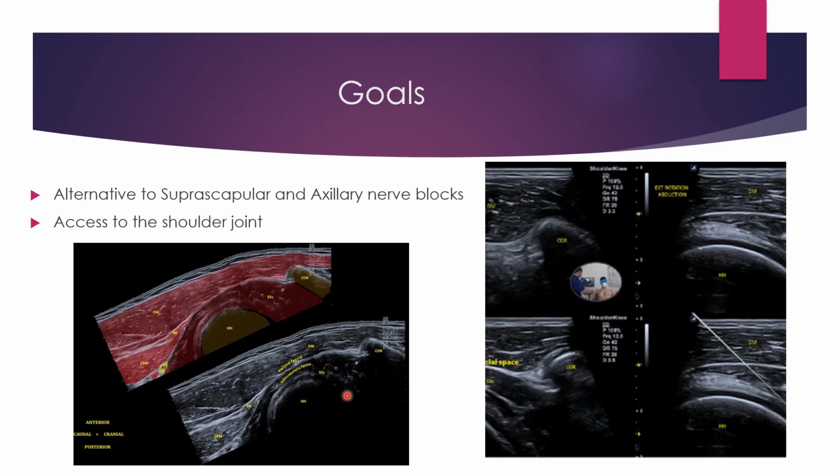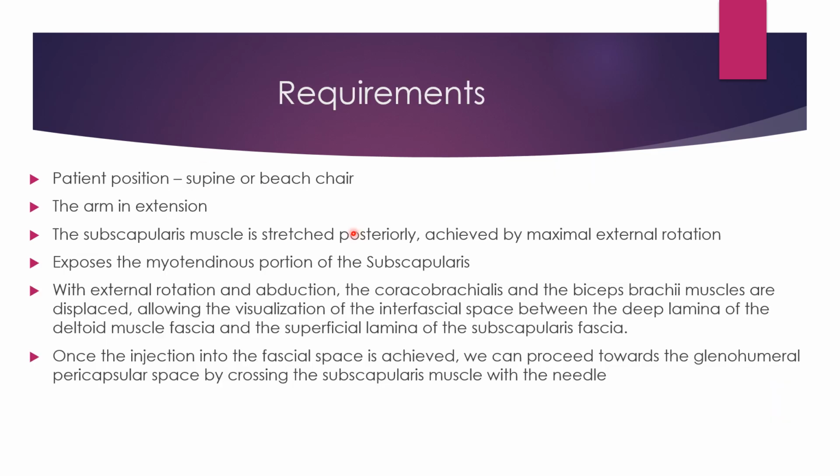Also, it can possibly provide access to the shoulder joint. Particularly, that is the point which I want to reiterate and discuss here. So what are the requirements? The patient can be very well in a supine position, or sometimes a beach chair will help.